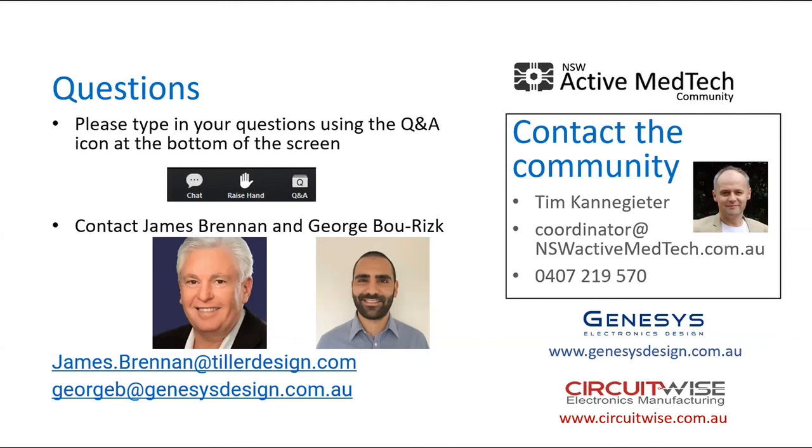If you look at Class C, curiously, the imposition of Class C over and above Class B is not that significant, and also aligns with good engineering practice. So it pays not to get too hung up on the class, and really only fall back to the Class A consideration if you can possibly put your SOUP into the Class A component. Class A does not require you to stress about SOUP. So that's really the barrier. But realistically, for any sensible device that's doing a reasonably function critical process, you're going to be dealing with Class B.